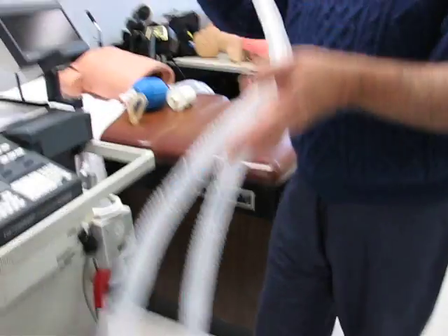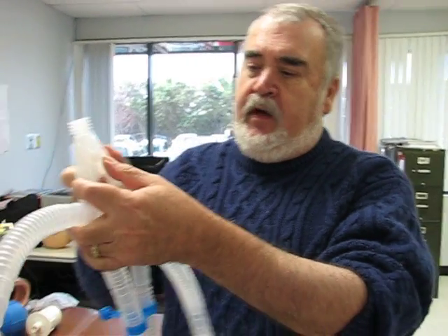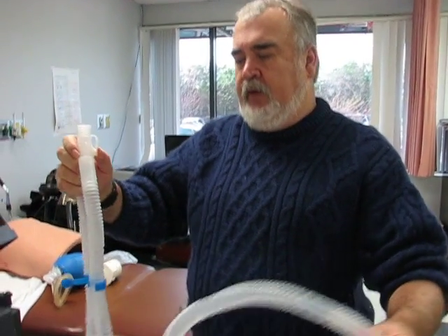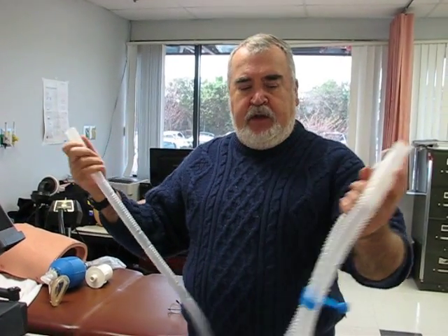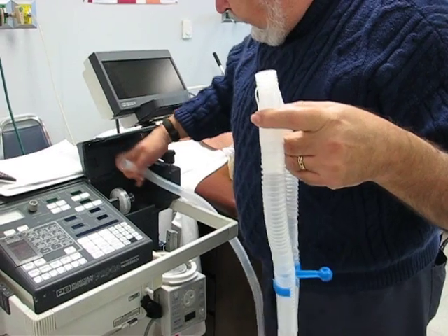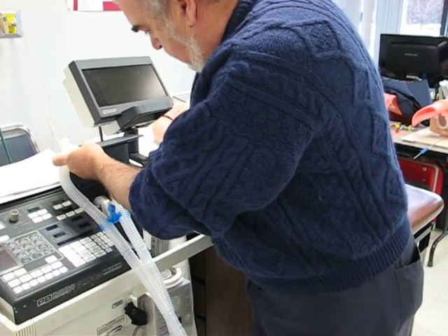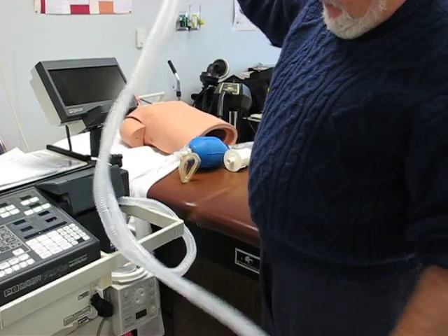You take your circuit. It's important that the inspiratory limb of the circuit be connected to the inspiratory filter. You can tell the inspiratory limb because it's the one that has this little tab — that's where the thermometer goes. If you had a heated humidifier in line, it would constantly show the temperature of the gas going in. So that end goes to the inspiratory filter, and the other one is the expiratory limb, which goes down the bottom here.